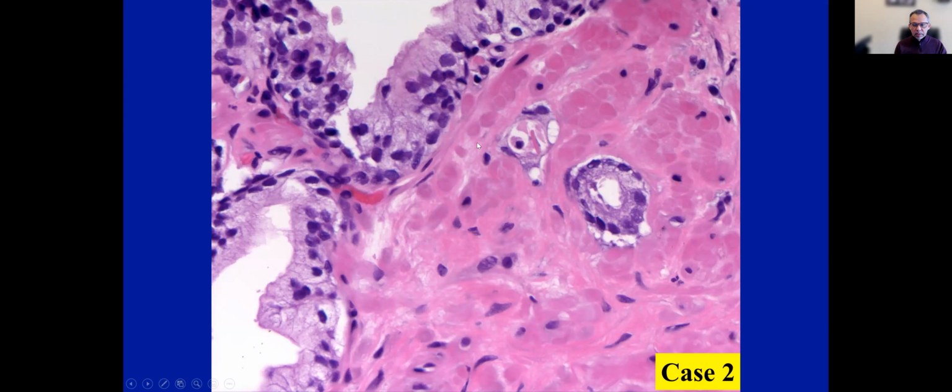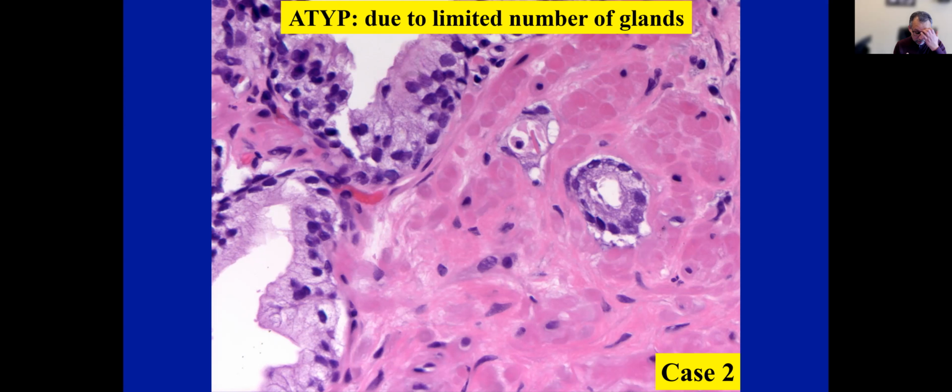So in this particular example, you will agree with me that these 2 glands are clearly atypical. There is an amphophilic cytoplasm that you can see in this gland. There is nuclear atypia, nuclear enlargement, some prominent nucleoli. You see crystalloid as a minor feature. So there are clearly some abnormal features, but the number of glands is insufficient in this example to make a confident diagnosis of cancer. When you see this type of situation, you have to look at multiple levels to see if the lesion grows. If it stays like this, then even immunohistochemistry likely would not change your diagnosis.